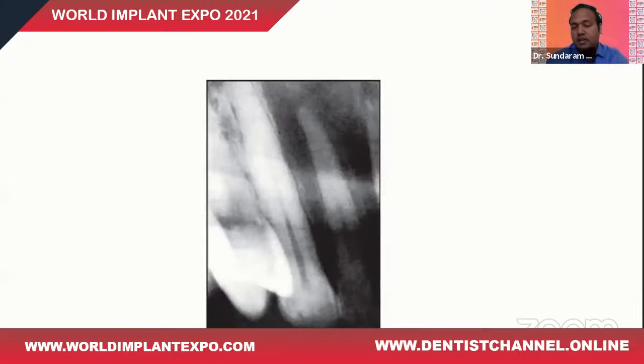Again, because of the improper angulation, you can see elongated images of the tooth. For instance, if I'm going to remove this root and place an implant there, I'm really not sure what dimension of implant I can place over there.